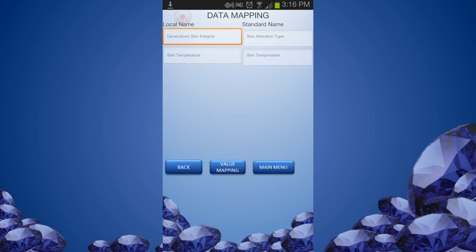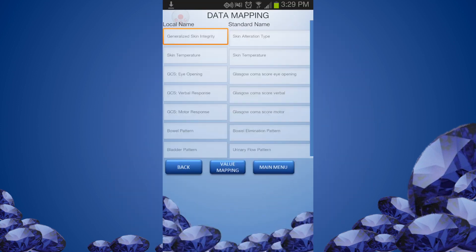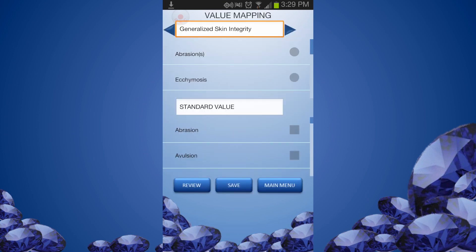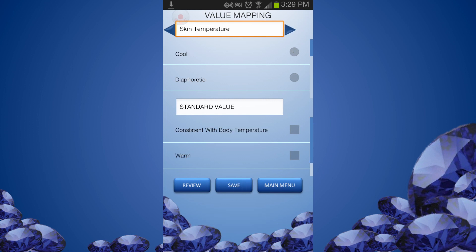You can move to the Value Mapping by clicking the Value Mapping button. The value mapping is done in the same way as the Name Mapping. You can go to the next value using the scroll arrow. When you complete one item, you can go to the next item using the scroll arrow next to the item name.